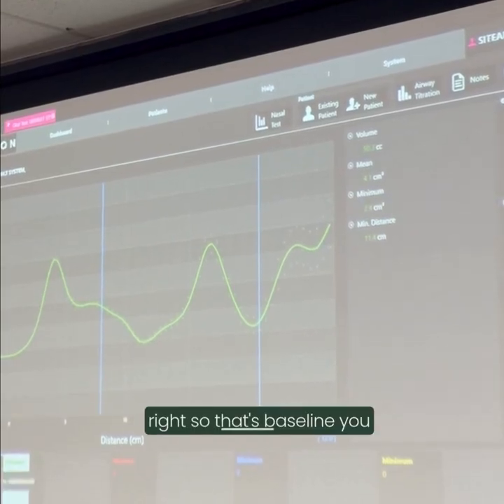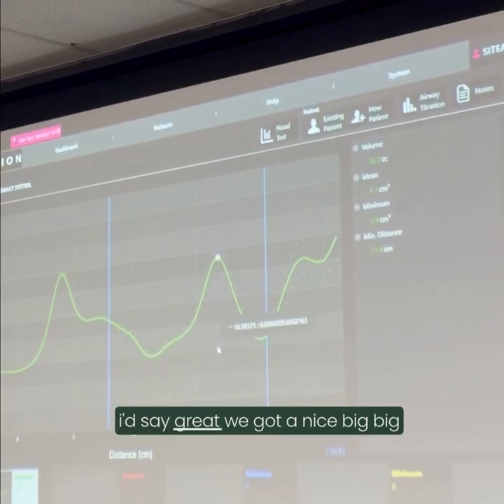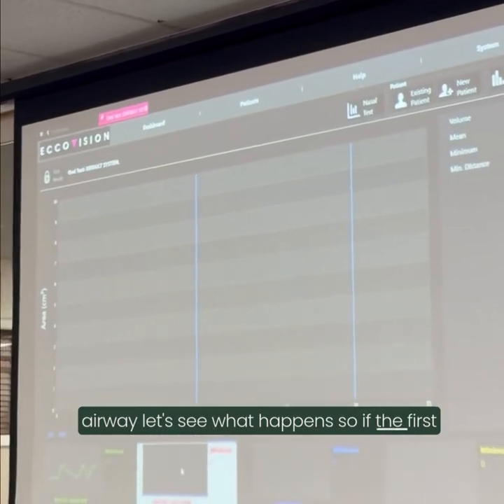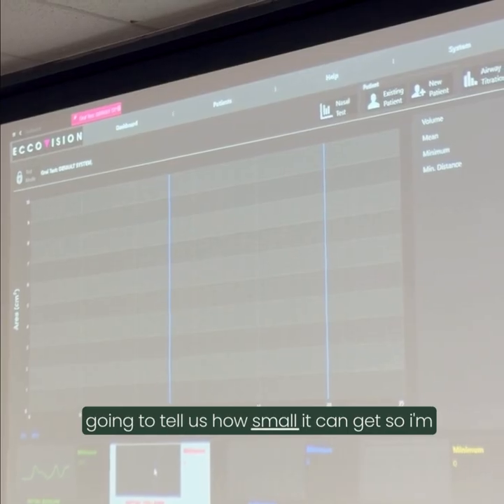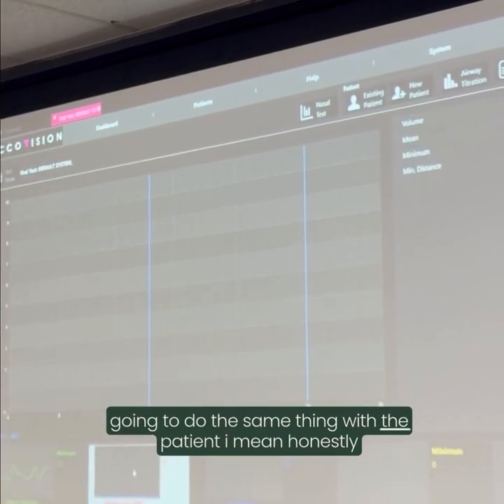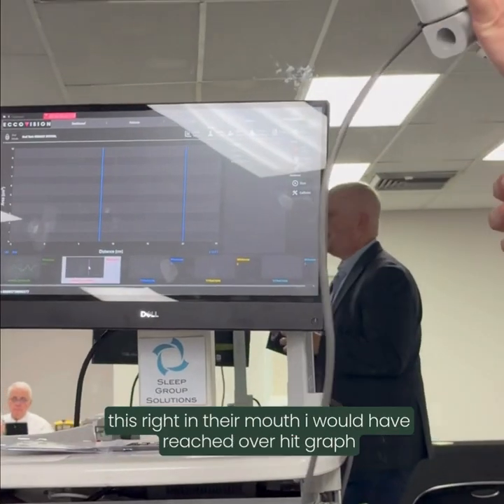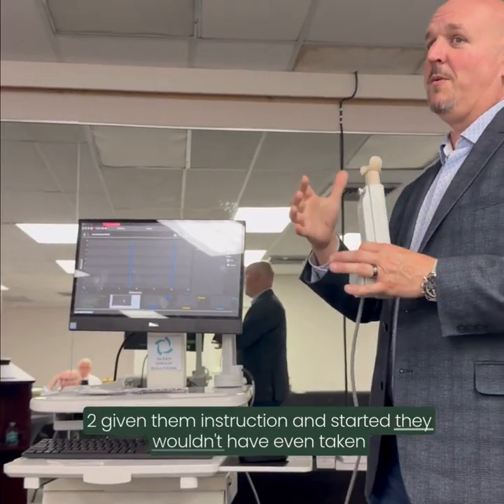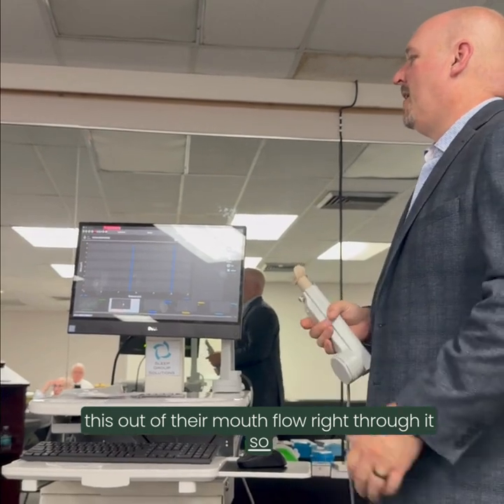All right, so that's baseline. If I sat down and looked at this reading, I'd say, great, we got a nice big airway, let's see what happens. So if the first test tells us how big the airway is, the second one's going to tell us how small it can get. So we're going to do the same thing with the patient. Honestly, if I wasn't talking so much, I would have just left this right in their mouth. I would have reached over, hit graph 2, given them instruction and started. They wouldn't have even taken this out of their mouth, we'd flow right through it.